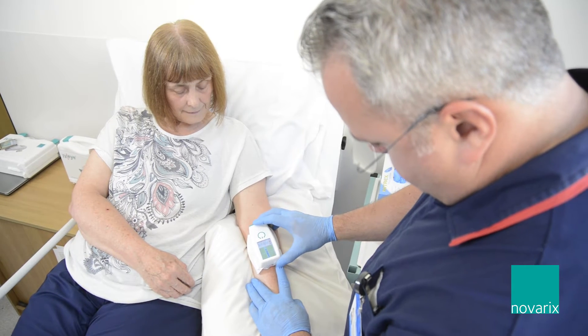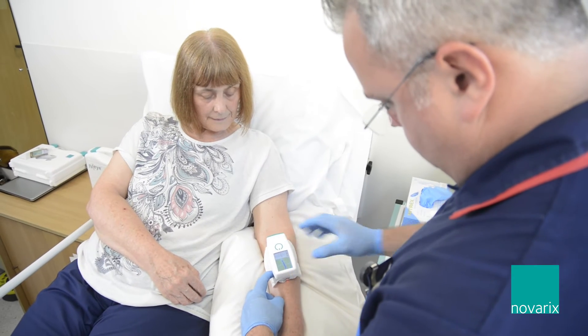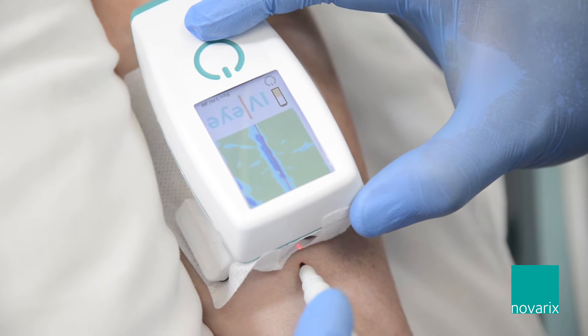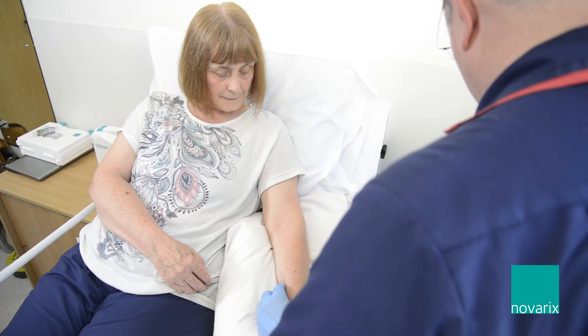We use the IVI as part of our assessment of patients when we go to cannulate them. We would use the IVI to look at the vessel health, look at blood refill, and the quality of the vein before we decide to place a cannula, or it could be that we then move on to a different technology.